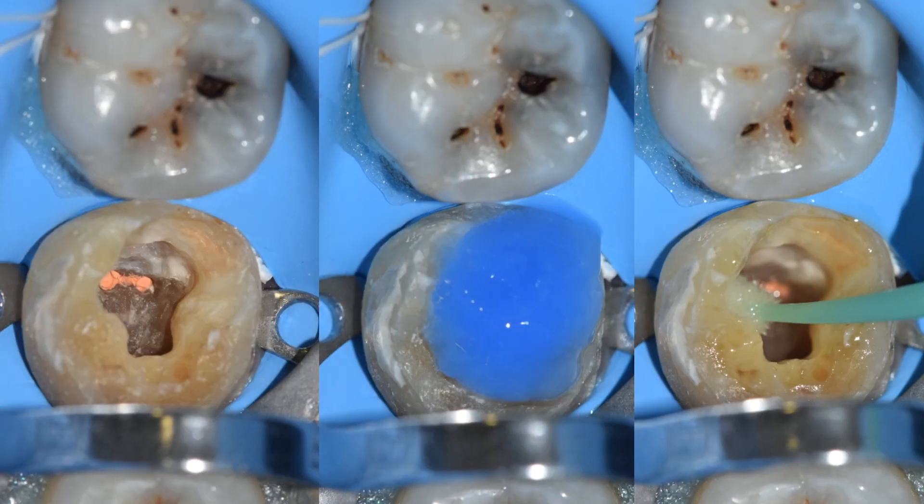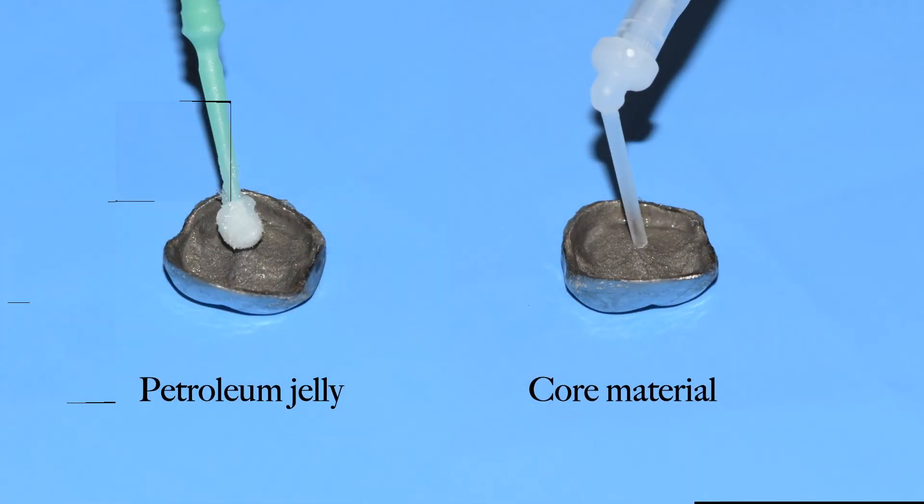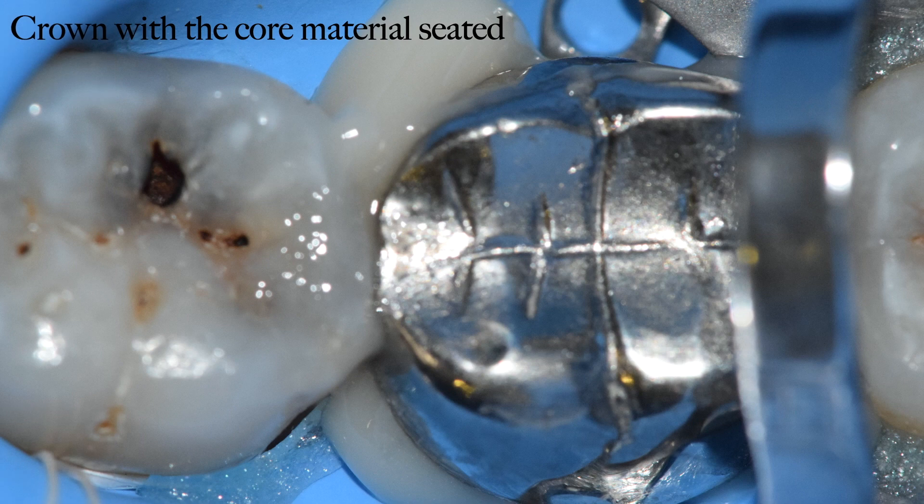Once everything is checked and we are good to go, the next step is caries removal — all the secondary decay that was there with the old core has been removed. The etchant has been placed in the cavity and the tooth was actively scrubbed with a micro brush. Once the etchant has been washed, the next step is adhesive application. Once the adhesive has been applied and light cured, the next step is preparation of our crown. I am applying the separating medium — petroleum jelly — on the intaglio surface and placing my dual cure core material inside the old crown. The same core material is also being filled up inside the tooth cavity, and once this is done, the metal crown is seated over the tooth. Then it is time to wait three to four minutes for the core material to set completely.